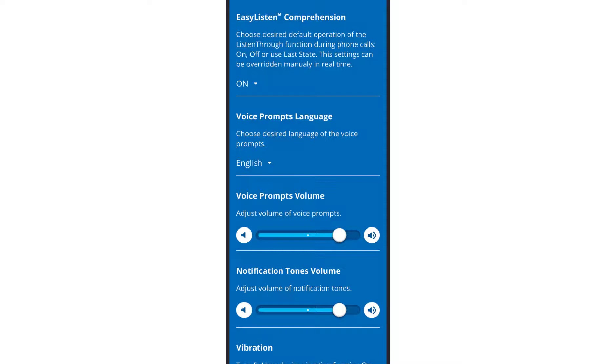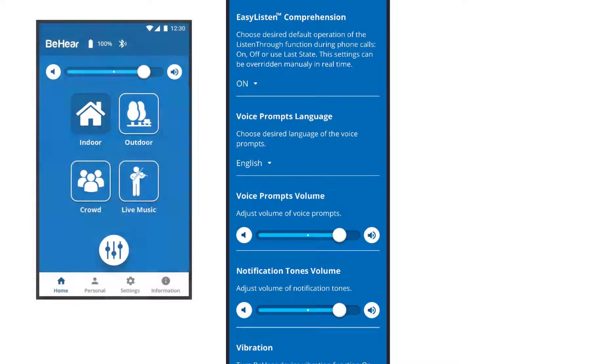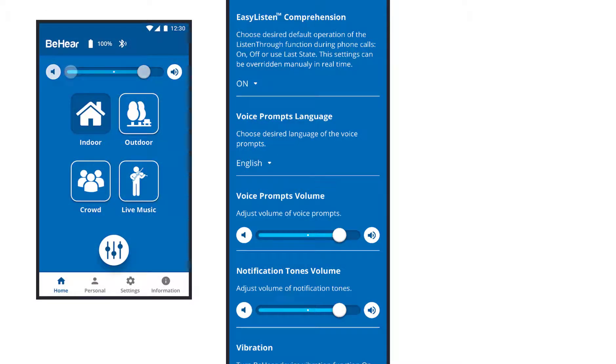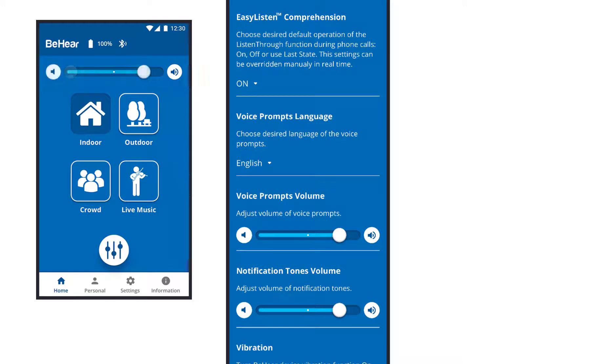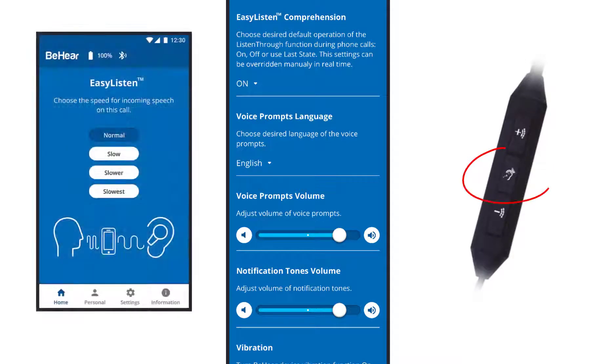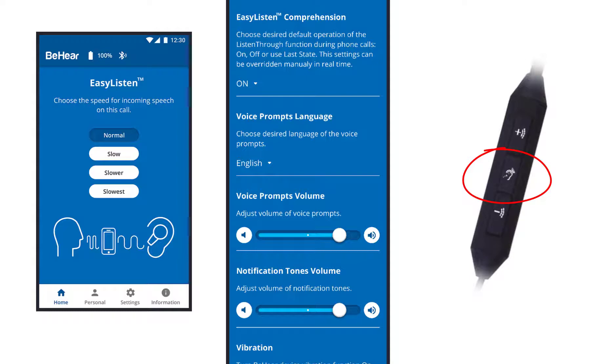This setting only affects the default state. You can always choose to turn the hearing mode on or off through the app's home screen, the notification panel, or by a long press on the middle button of the right control box for personal hearing and listen through. For easy listen, short presses on the middle button of the right control box scroll through the four available tempos.